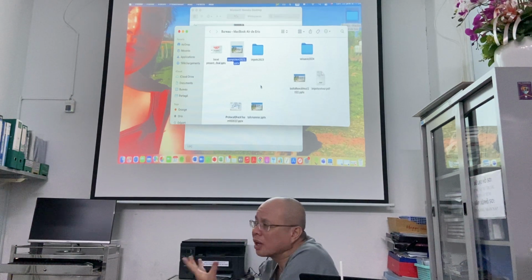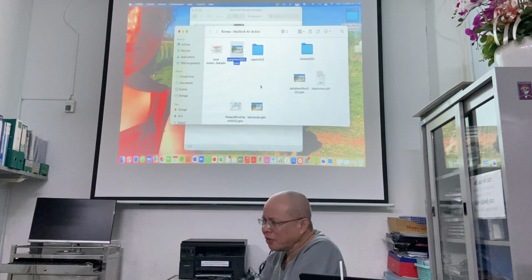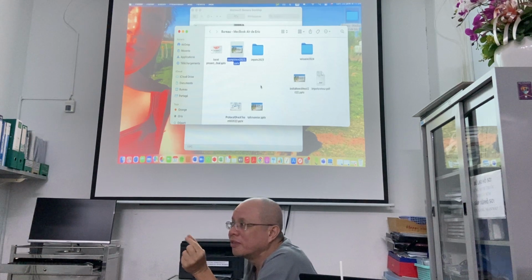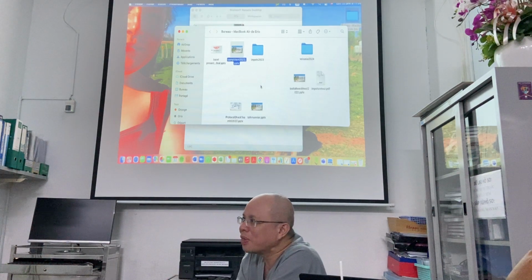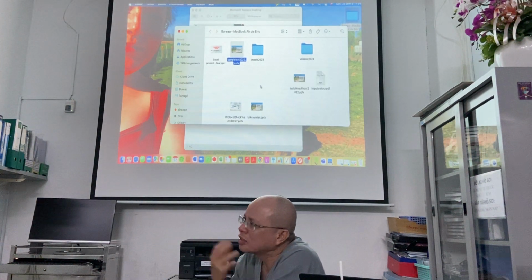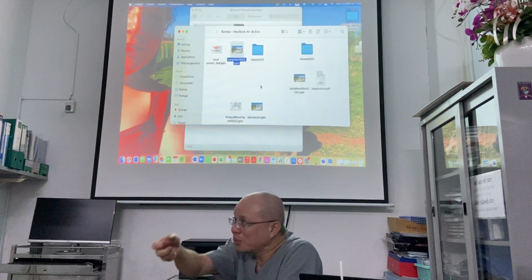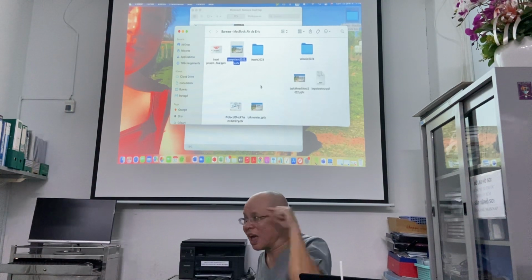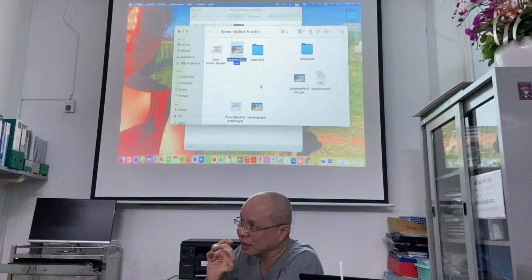Short VT, short VT. So I think it's an unstable situation. Even though there's only a small amount of fluid in the collection, we cannot puncture it. So I think it's not a good decision, but I have no choice. I withdraw. And after we close the sheath out, I also had the horn of the sheath in the myocardium.